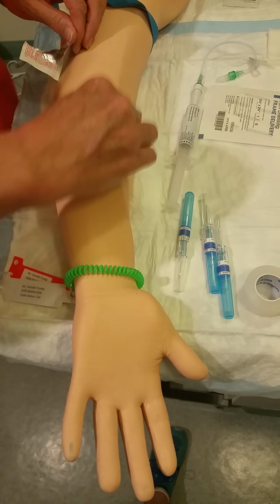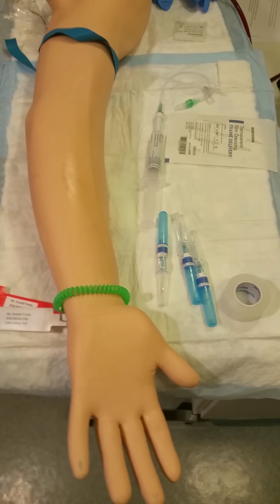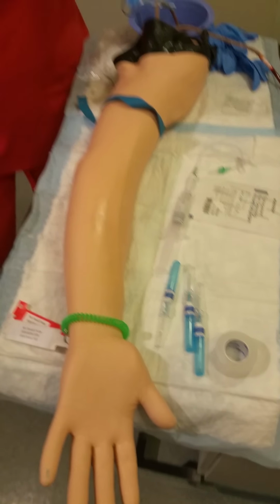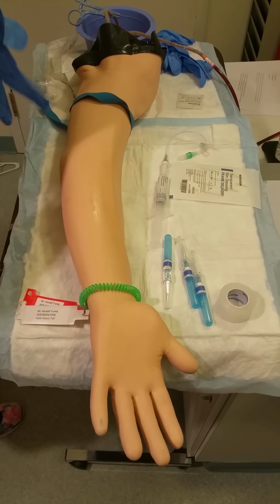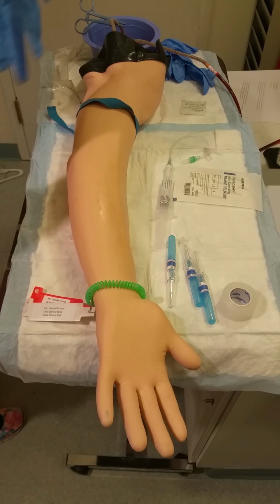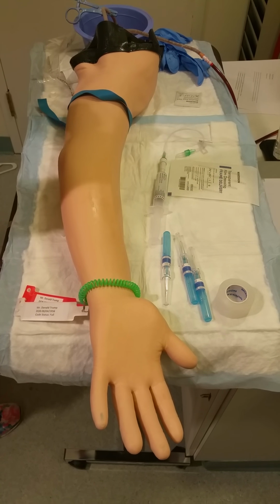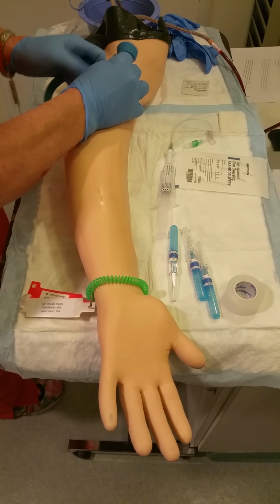After 15 to 30 seconds, I can just go ahead and let that dry while I put on my exam gloves. And re-tie my tourniquet so the vein is engorged when I puncture.